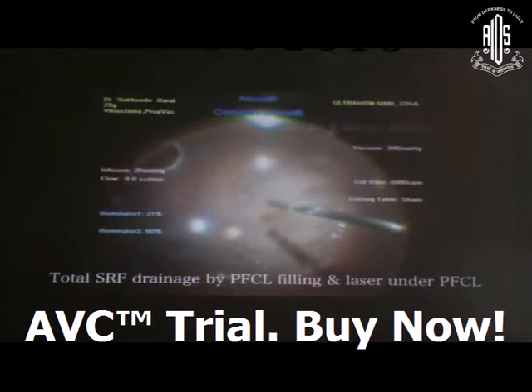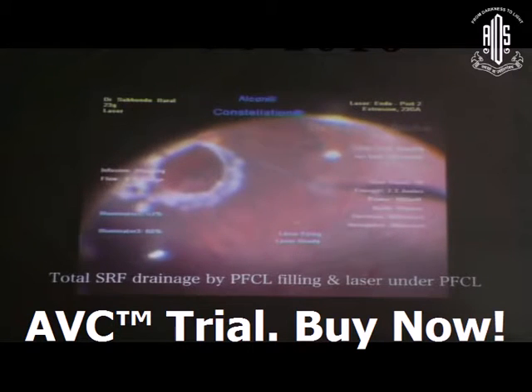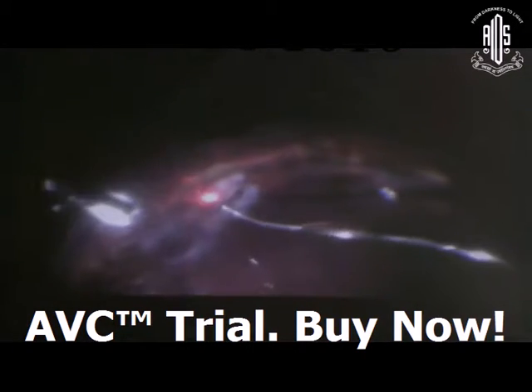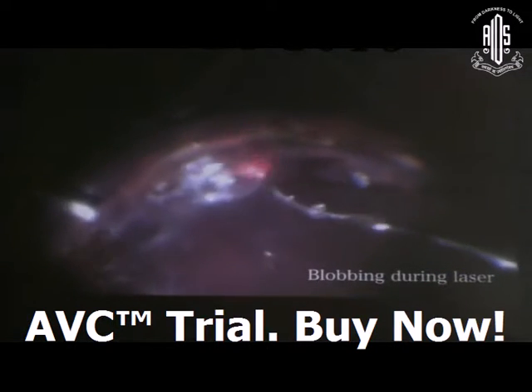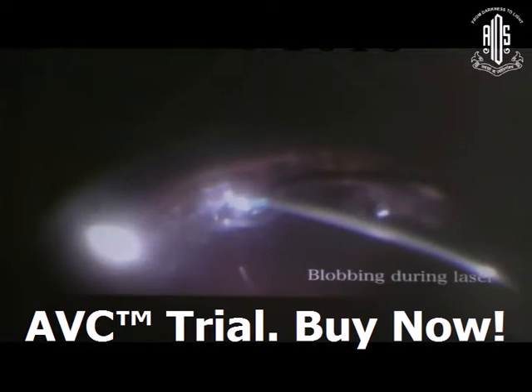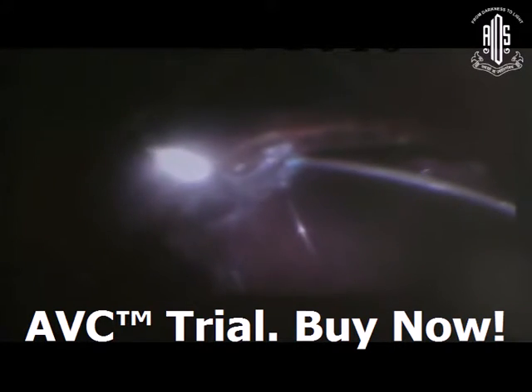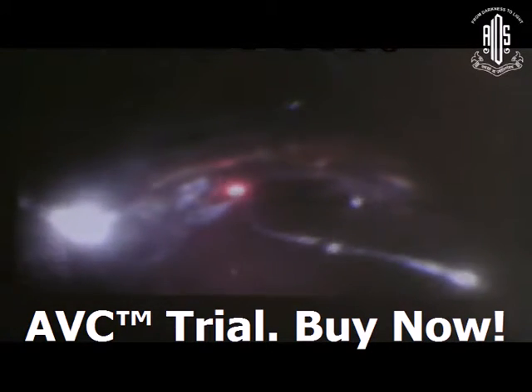Sometimes you can drain all the SRF by filling the vitreous cavity fully with PFCL, then do laser under PFCL. Laser under PFCL is very safe. Blobbing during laser is a very common situation and means there is subretinal fluid present. You have to gently aspirate the subretinal fluid and then do laser around the iatrogenic break.